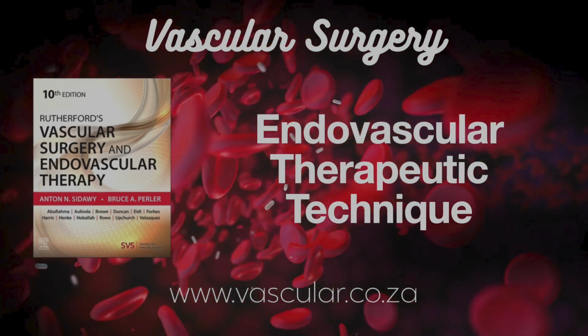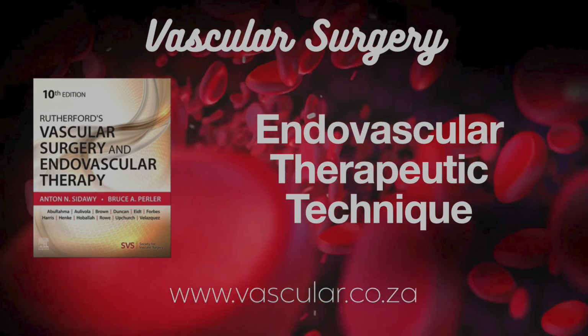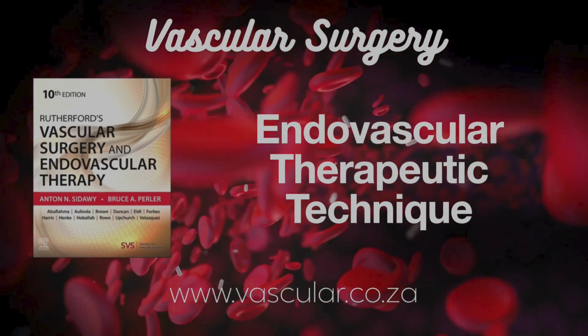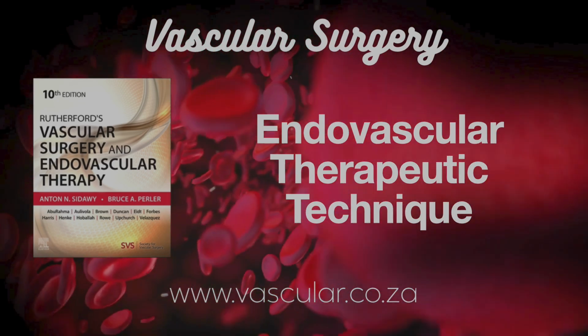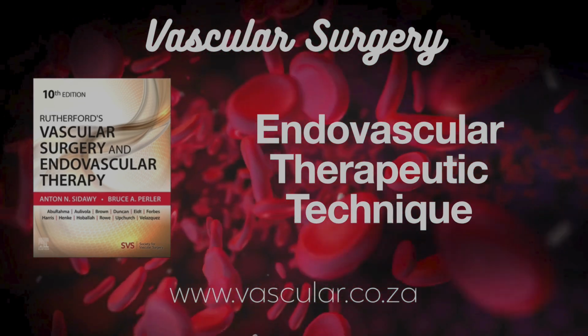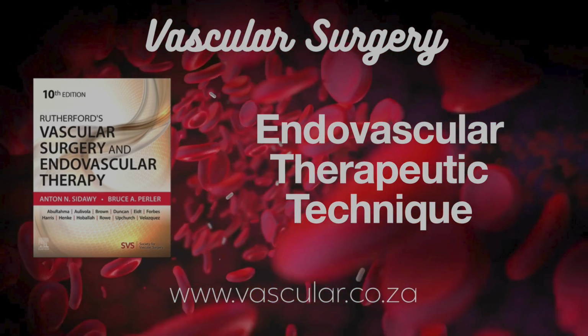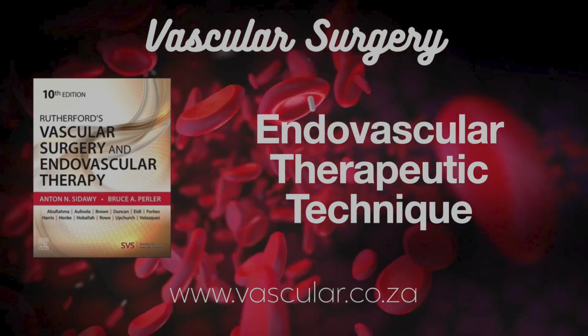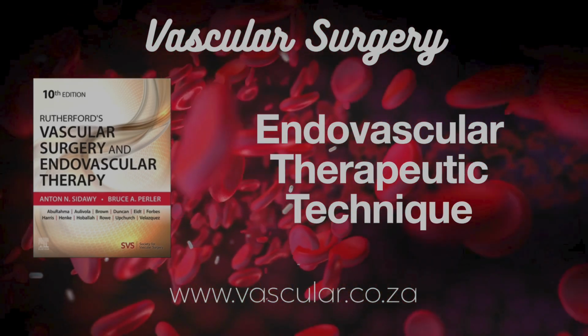Okay, wires across. Now, balloon angioplasty itself. How do you choose the right balloon? Based on reference vessel diameter, the healthy artery size next to the lesion, and lesion length. Balloons come in a huge range of diameters and lengths now, up to 30 centimeters long. Sizing strategy: often stepwise. Start slightly undersized, see how it dilates, assess stiffness, then size up to match the reference vessel. Be cautious with calcium.